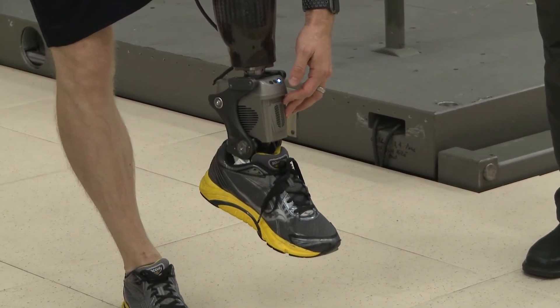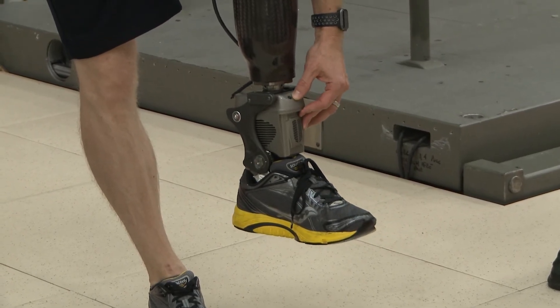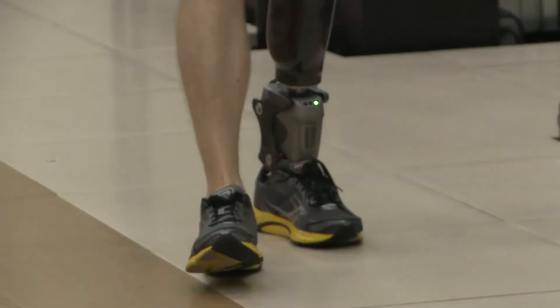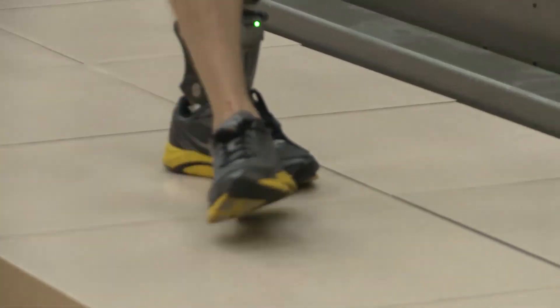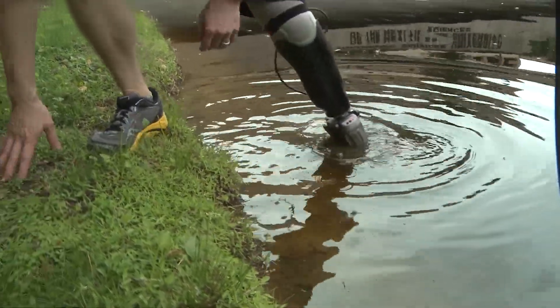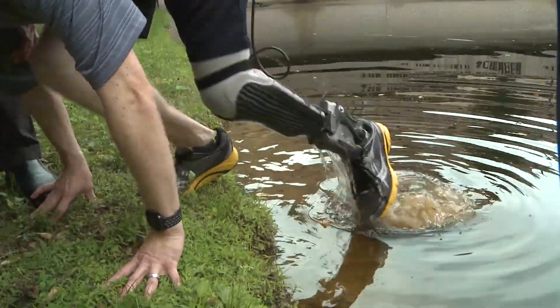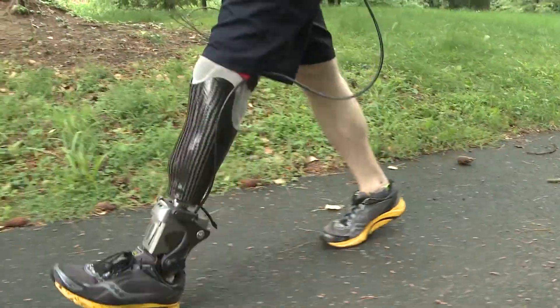The weight of this unit is 2.4 kilograms, about 0.2 kilograms heavier than the current mPower, and it's on par with the last prototype. But the last prototype was not submersible. So we basically added the ability to be dunked in water and support the running gait without increasing the weight from that iteration.